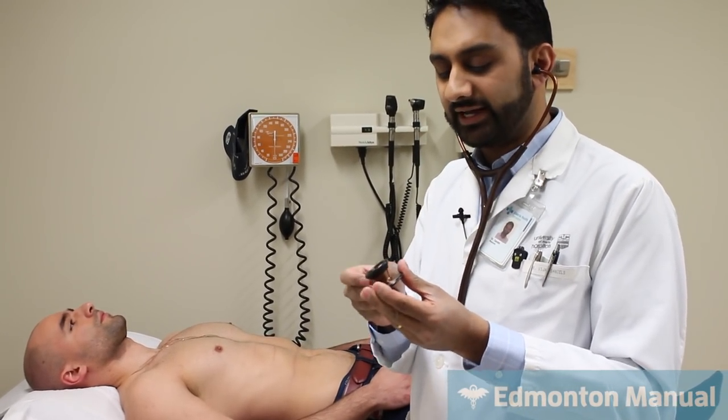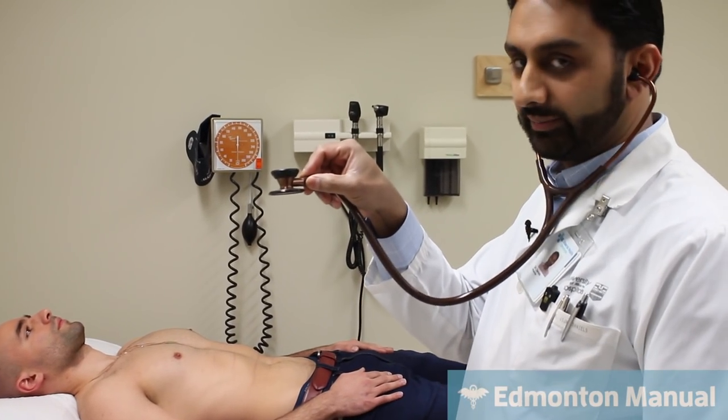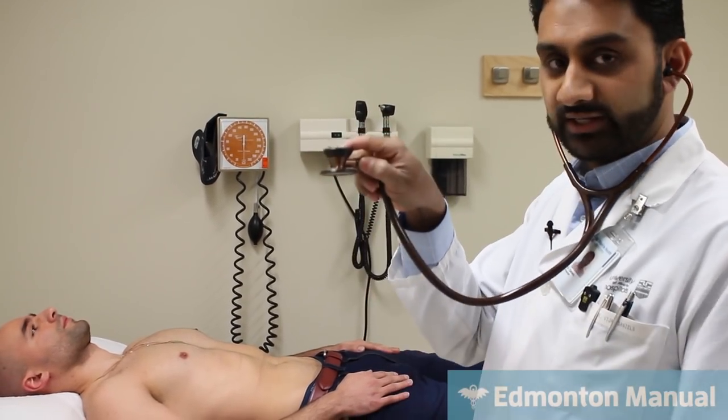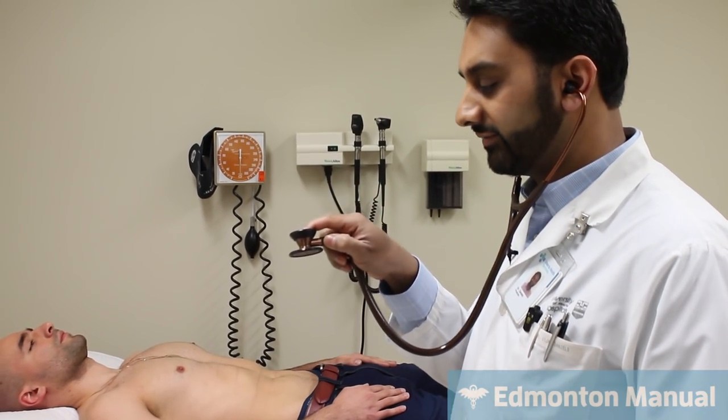What I find tends to help is if I just hold the stethoscope right here, I can still get a good grip. What some people like to do is put their fingers through like this, and that works as well. You may find that doing this works just fine. You don't get a lot of extra noise, but it all depends. So try a variety of things.